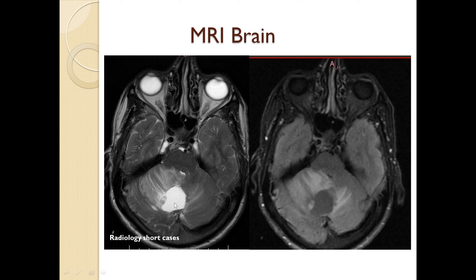These are axial T2-weighted and axial FLAIR images of the brain. We can see there is a well-defined hyper-intense cystic lesion in the right cerebellum and vermis with an iso to hyper-intense mural nodule at the periphery and surrounding vasogenic edema. This edema is causing compression of the brainstem and fourth ventricle. Similar findings we can appreciate on the FLAIR images. The mural nodule here is hyper-intense and the edema is also extending into the left cerebellum.